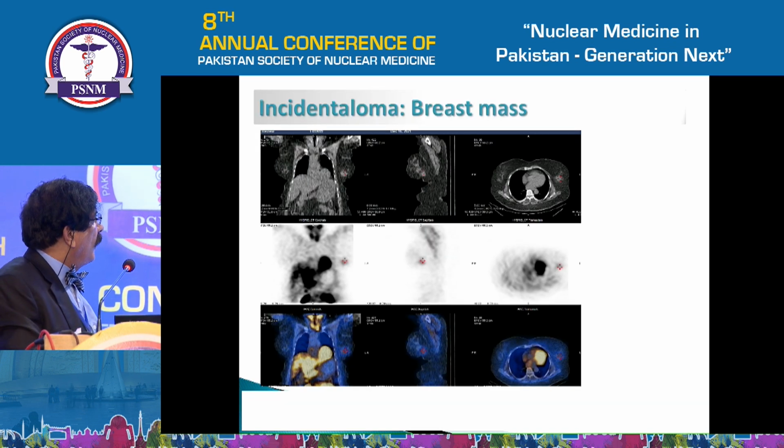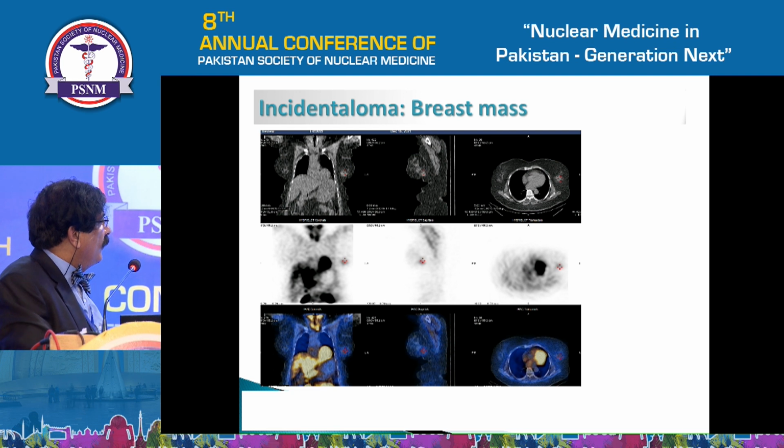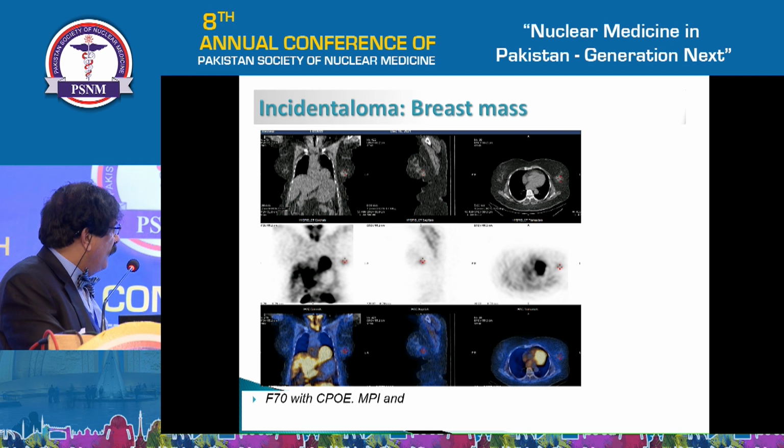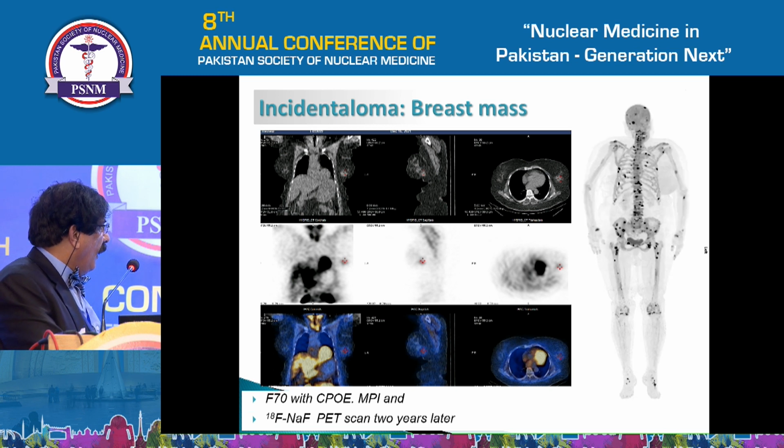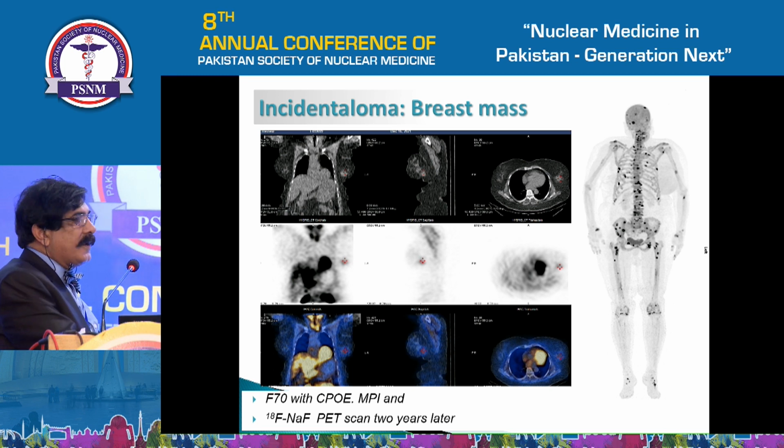So just to show you an example. I was looking at this and I looked at the CT part, and you can see a breast mass here on the left side, which also has MyoView uptake, and we put that in our report, but nobody did anything about it because they were not really interested. And 2 years later, the patient came up with this sodium fluoride scan with multiple metastases.